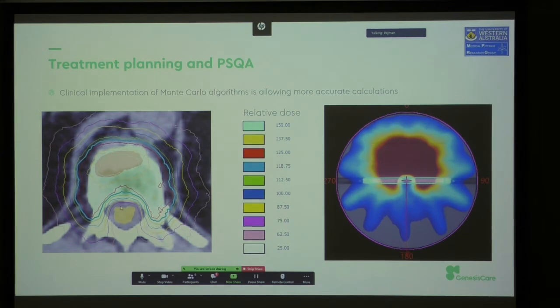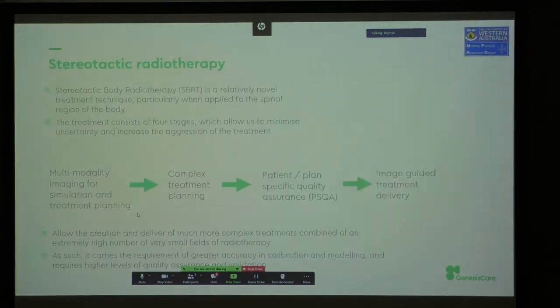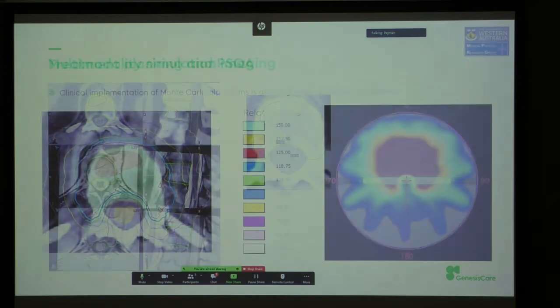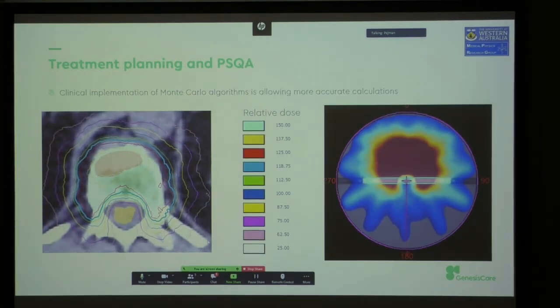So this is the same patient with a clinical plan. Not too much about what these doses are, but the concept being that this isodose line here is the 62% isodose line, and this line here on the back of the treatment volume is the 100% isodose line. So we've got an almost 40% decrease in dose across that 4 millimeters. So you don't need to buy a particularly large amount of space to be able to get a lot more aggressive with these treatments. Whereas before, in conventional radiotherapy, we're seeing excess dose into the spinal cord. Just by generating that 4 millimeter gap, we can get the dose down by 40% and allow these safe treatments.